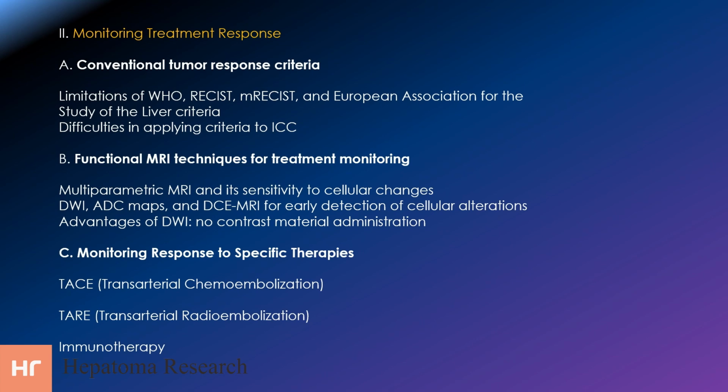Low ADC values indicate a highly cellular tumor with restricted water molecule mobility, while increased ADC values suggest cellular necrosis and damage. DWI doesn't require contrast material administration, making it suitable for patients with kidney disease or contrast material allergies.